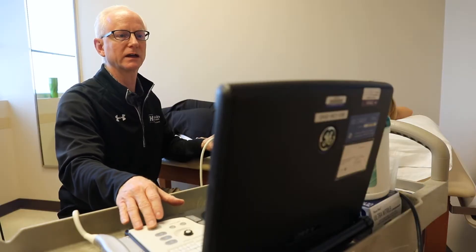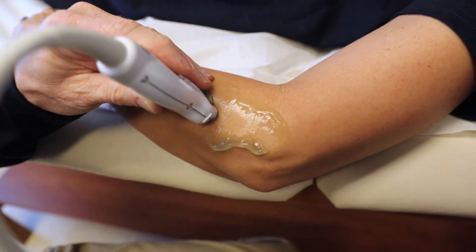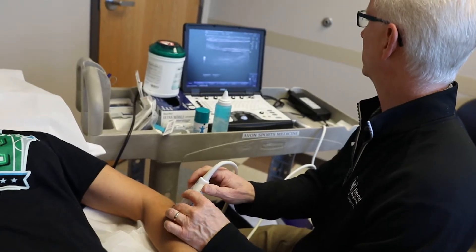Just like for women who have babies, the ultrasound is used for imaging the baby — we use it for musculoskeletal things like tendons, muscles, and ligaments.